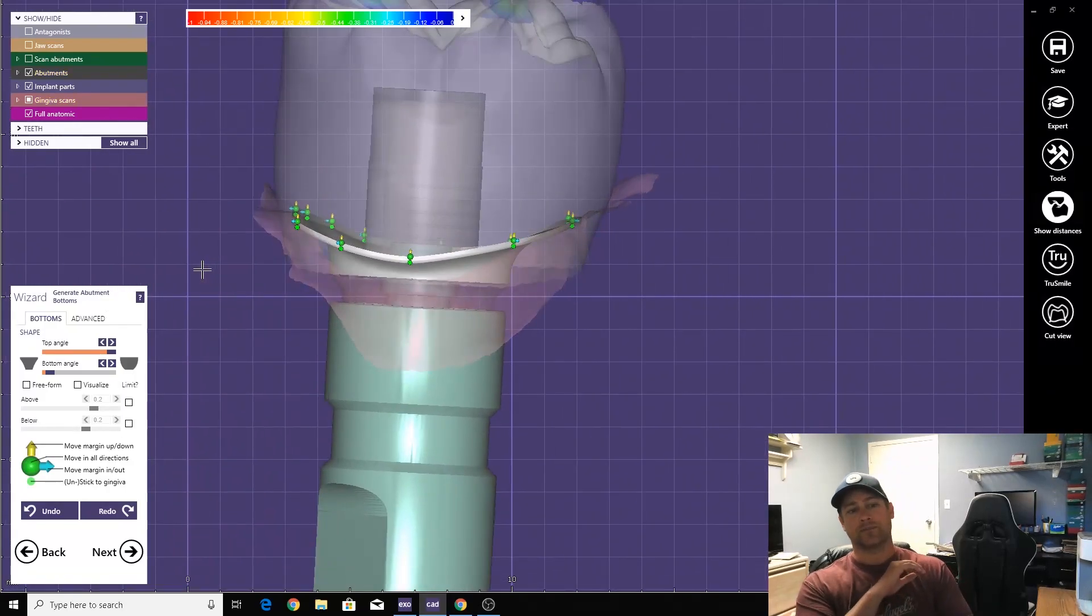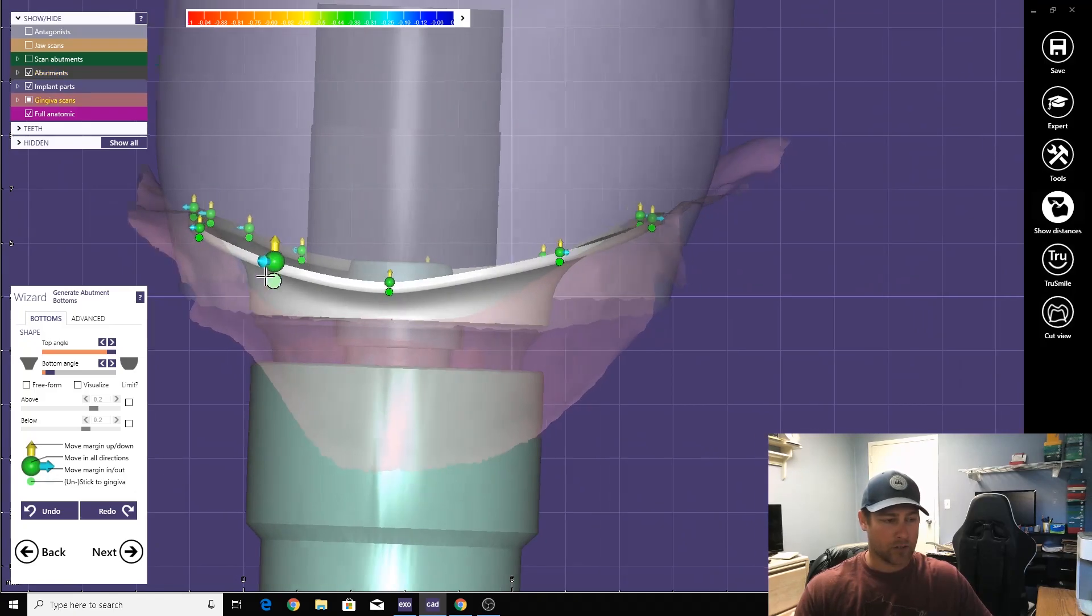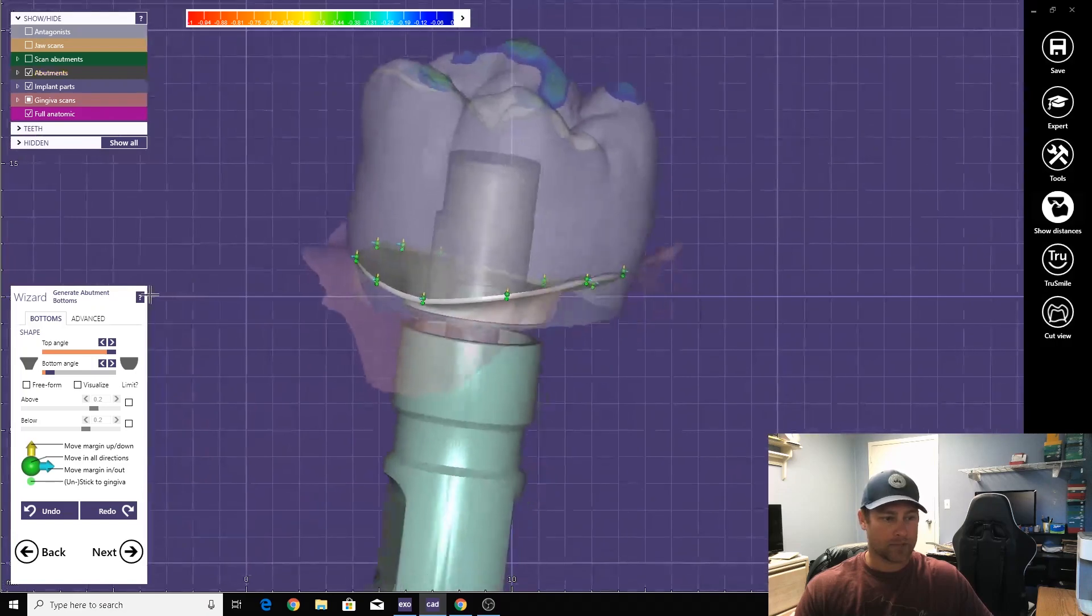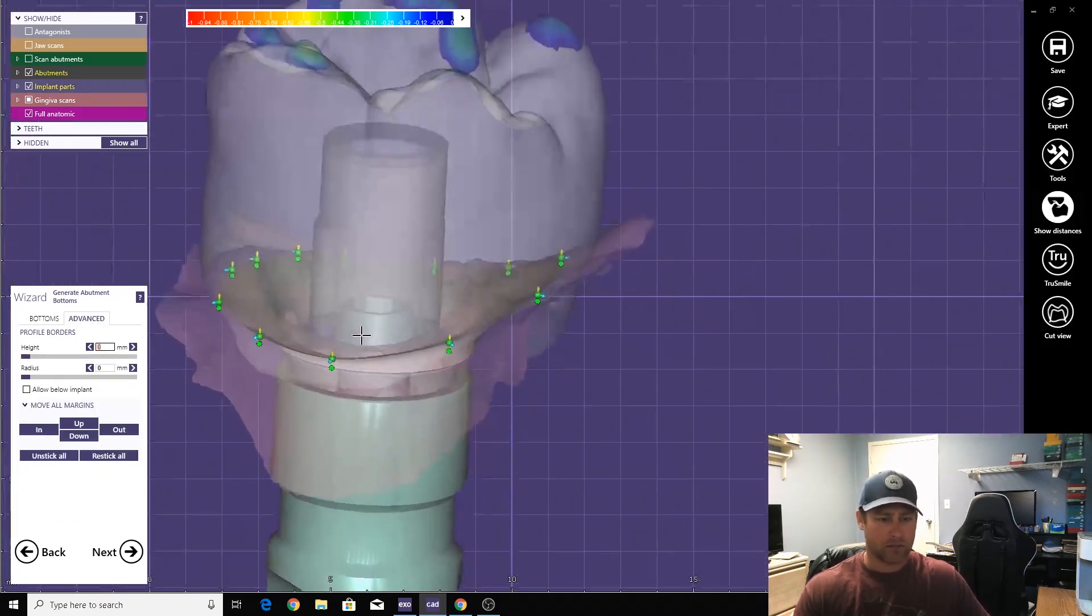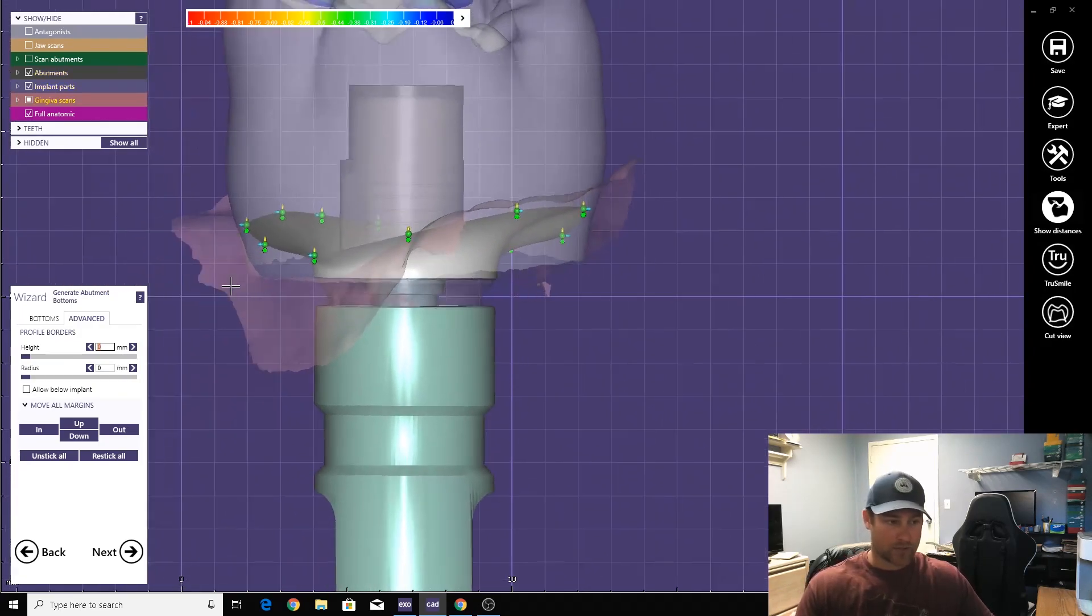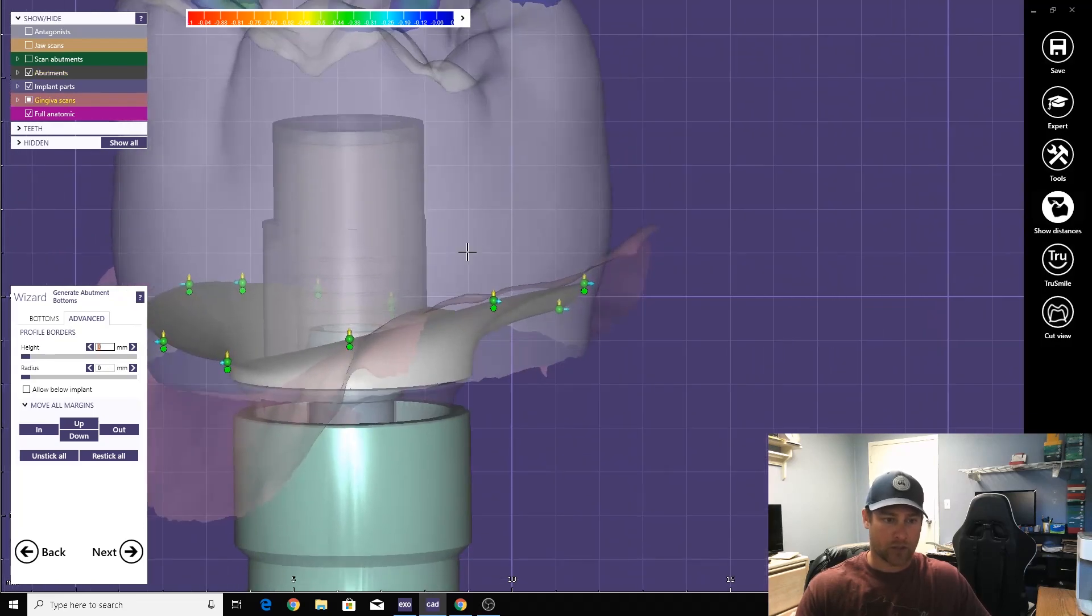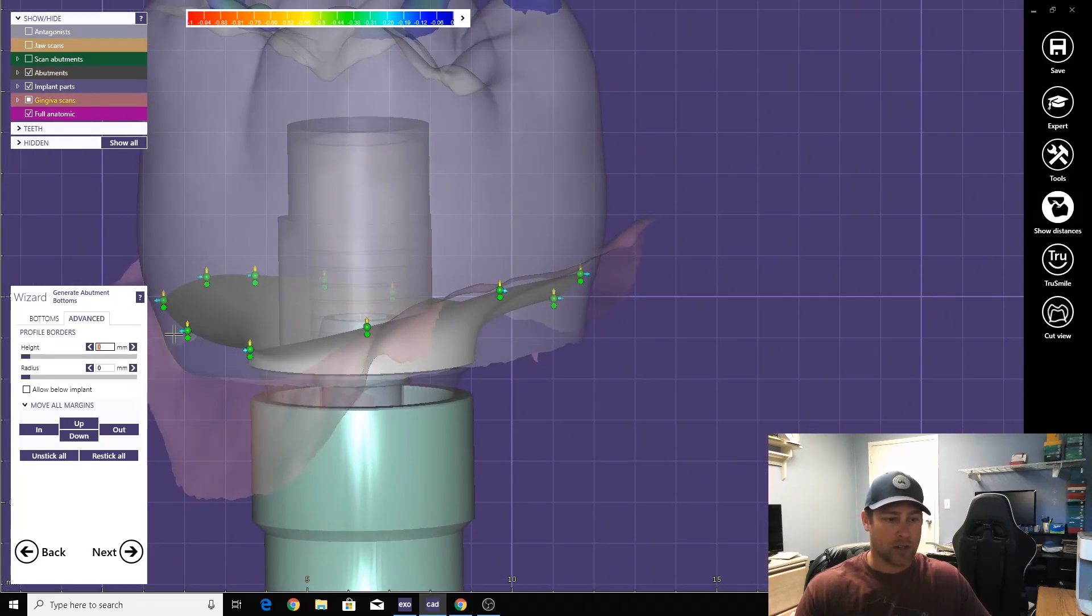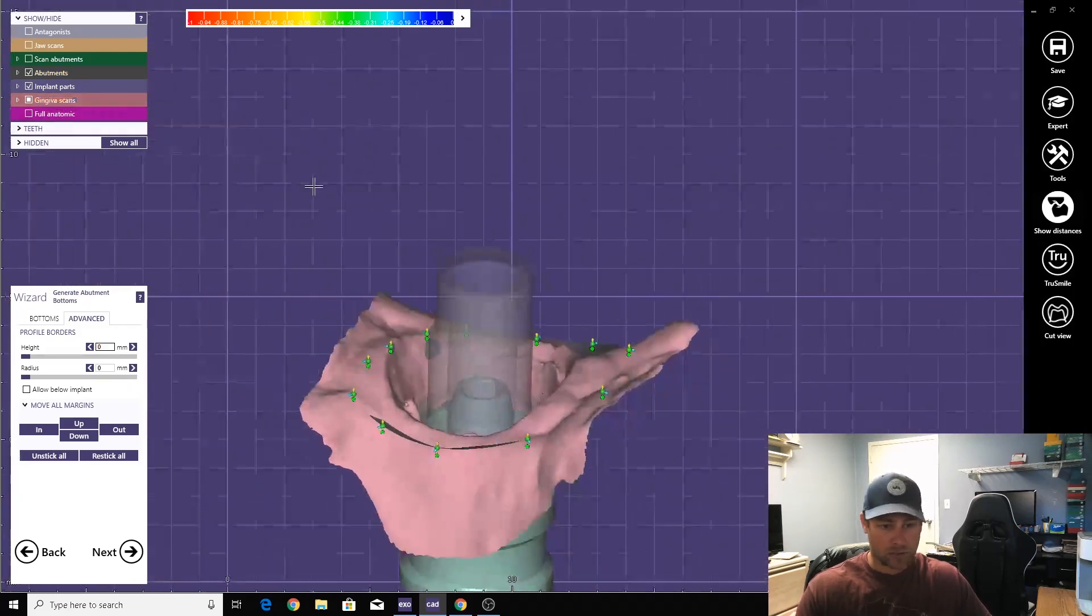Screw-retained zirconia, since it's all one piece, it's all going to be zirconia from here down to here. We don't want this big fat little lip right here. Come to advanced, make this zero. Give it a nice crisp margin line. It's not going to chip or anything like that because it's all one piece of zirconia, and you'll see at the end.